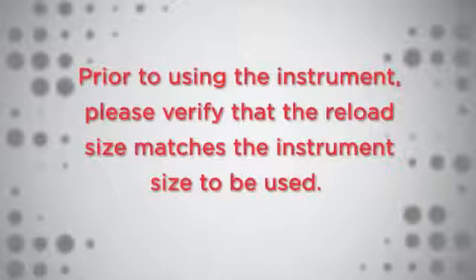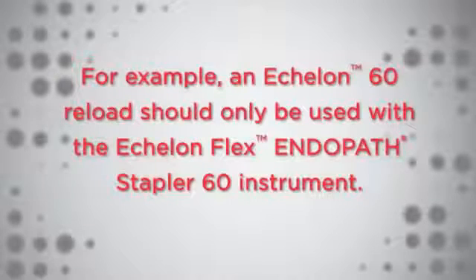Prior to using the instrument, please verify that the reload size matches the instrument size to be used. For example, an Echelon 60 reload should only be used with the Echelon Flex Endopath Stapler 60 instrument.